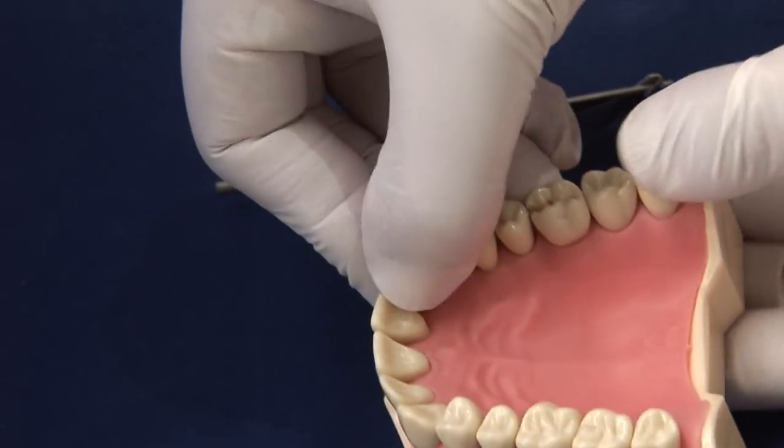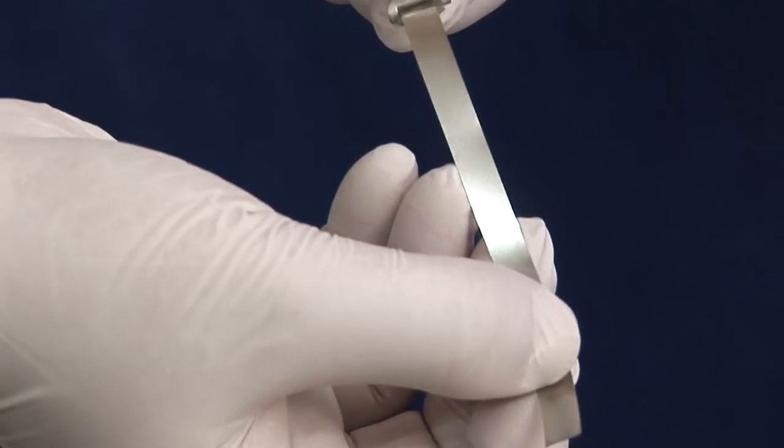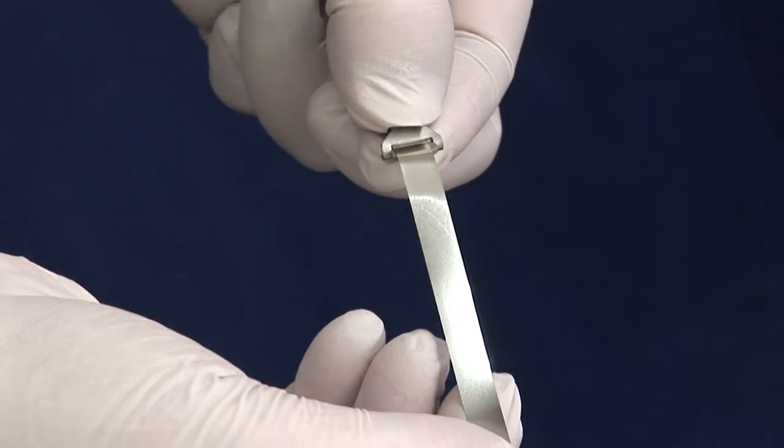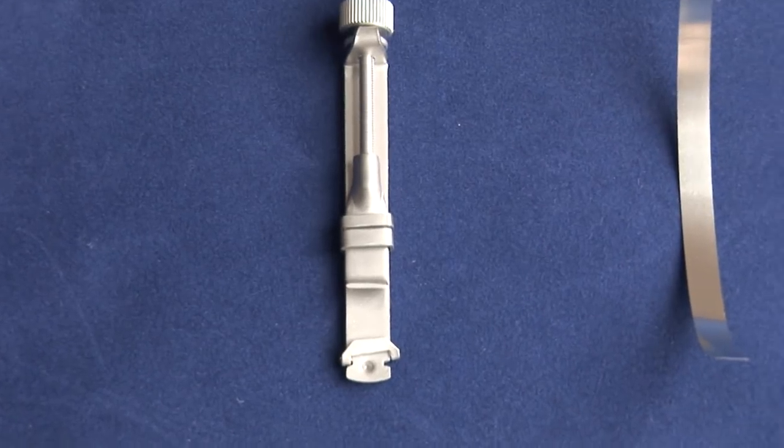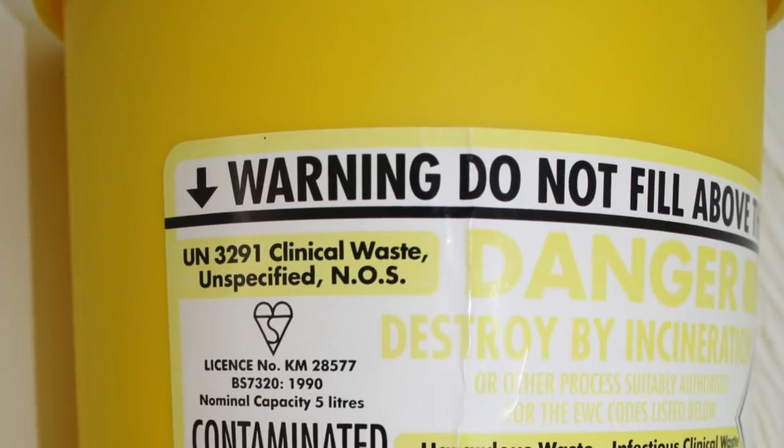Unwind the matrix band in the reverse order to the application. Remove carefully, remembering the sides of the matrix band can become sharp. Place the matrix band in a sharps bin.